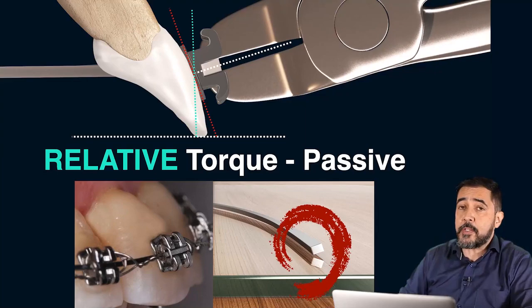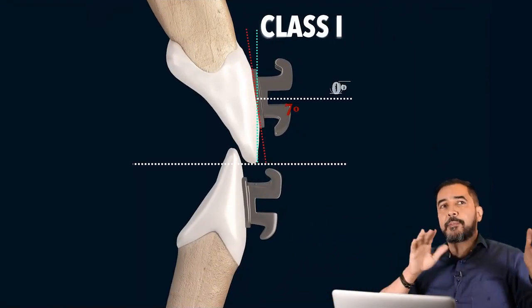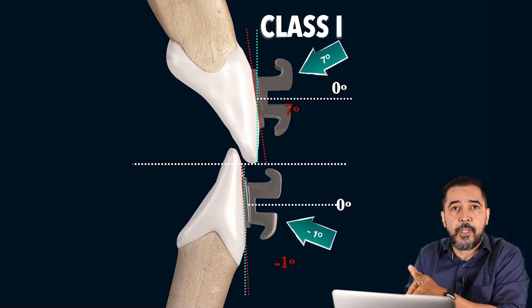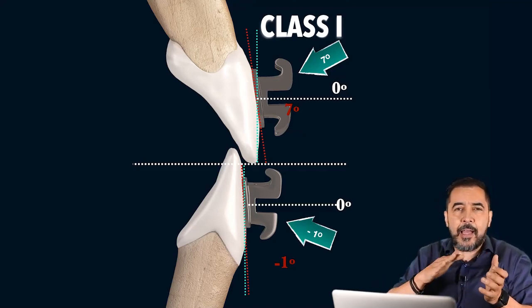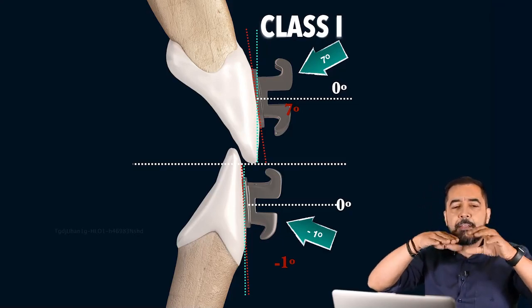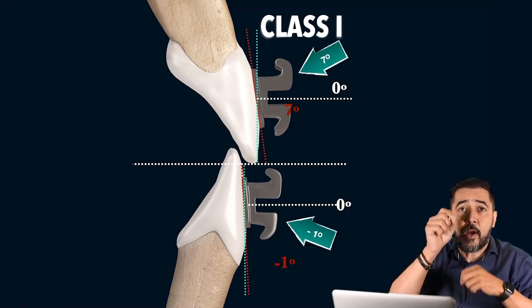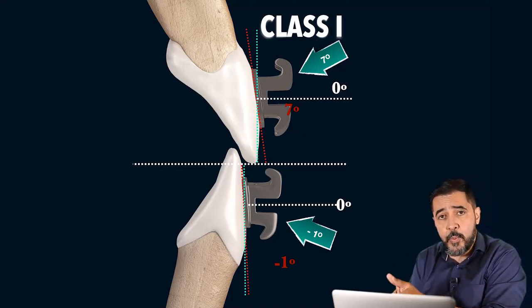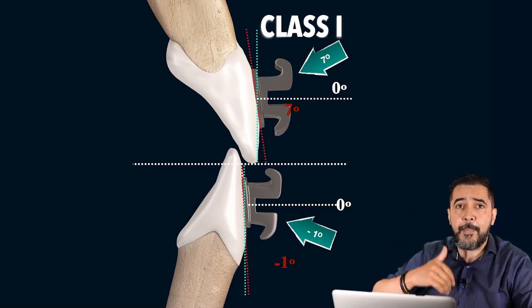This is important because sometimes we want to keep this inclination, and we want to adapt the inclination of those teeth in another phase of our treatment. So sometimes you just want to incline a little bit, and we do a very little torsion, and this little torsion generates a very, very light couple, which will do the inclination that we want. And this is the benefit of orthodontics. We can see what is happening the next time the patient comes back to our office.